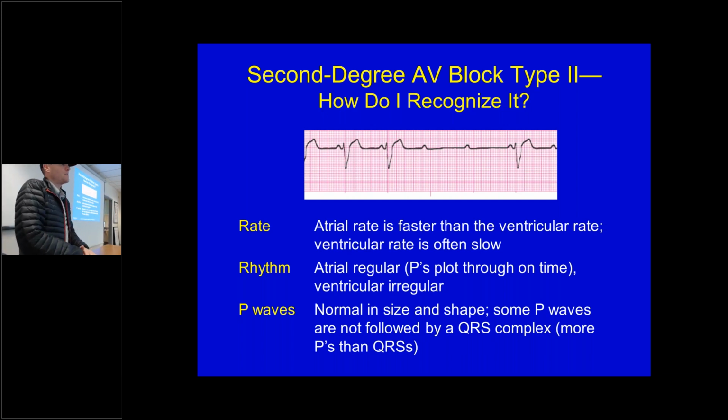I mean, you're not going to be asked about that nitty gritty. Overall, you just need to look at the whole QRS complex as a whole and say it's wide. All right, it's above 0.12. If it's between 0.1 and 0.12, that's incomplete. That's when we're talking about bundle branch blocks.